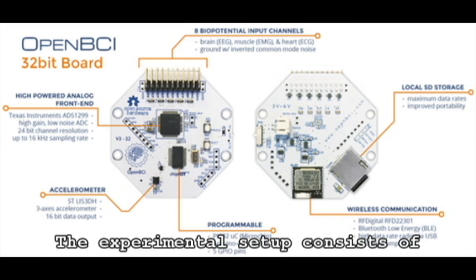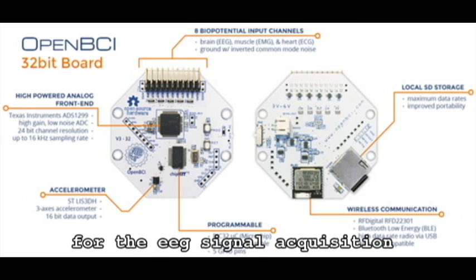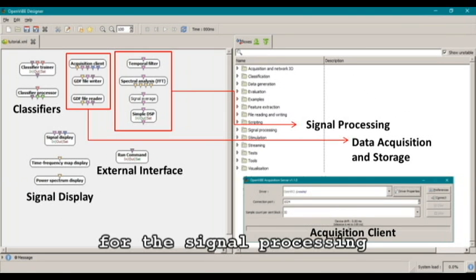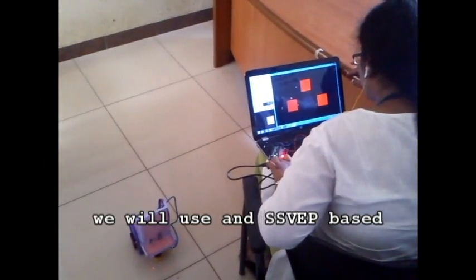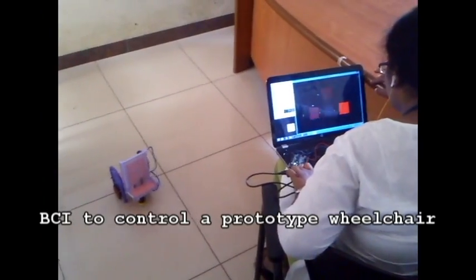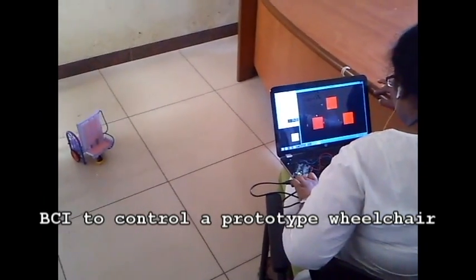The experimental setup consists of the OpenBCI board for the EEG signal acquisition and OpenViBE software for the signal processing and classification. In this demo, we will use an SSVEP based BCI to control a prototype wheelchair.